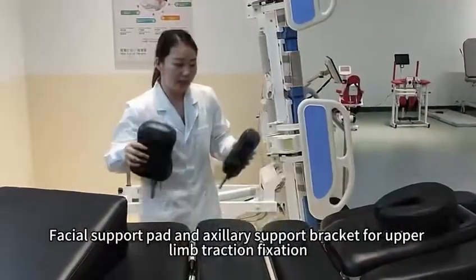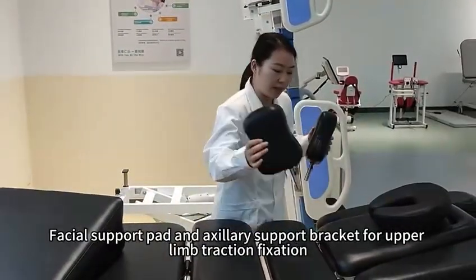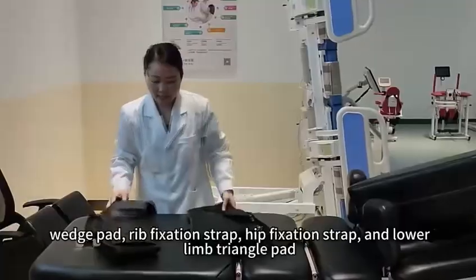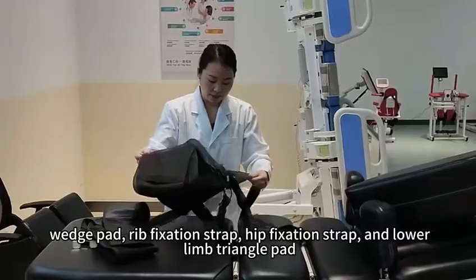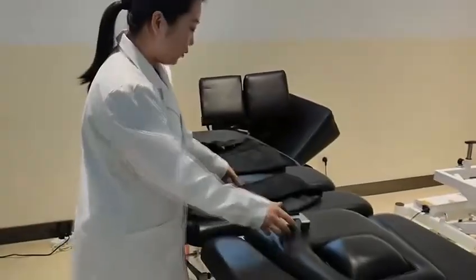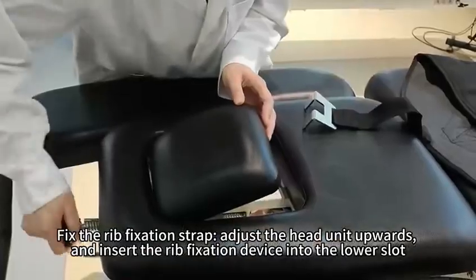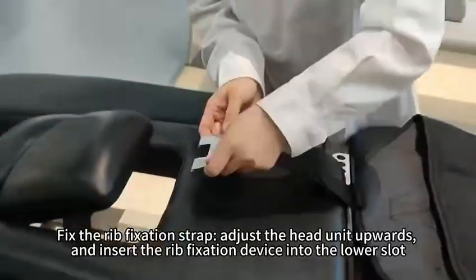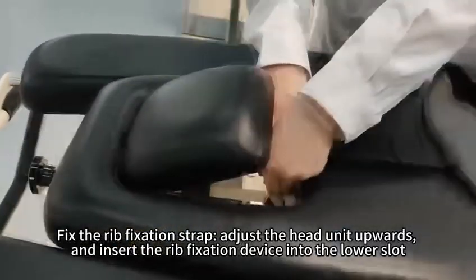Facial support pad and axillary support bracket for upper limb traction fixation. Wedge pad, rib fixation strap, hip fixation strap, and lower limb triangle pad. Fix the rib fixation strap, adjust the head unit upwards, and insert the rib fixation device into the lower slot.